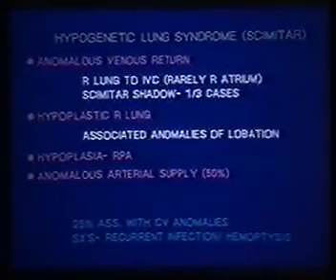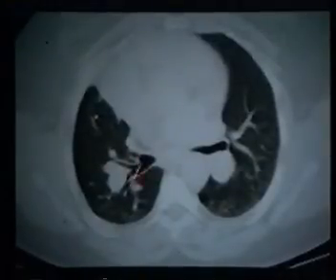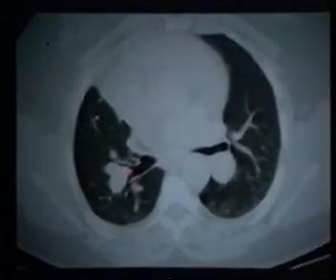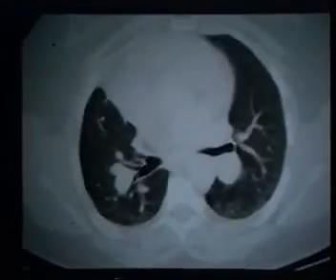Typically, these present without any kind of symptomatology. Now, we can make the diagnosis, I think, easily enough on a plain film. What we see on CT are anomalies of lobation. This represents really a left upper lobe bronchus on the right side. You can see there's hypoinflation of the lung and shift of the heart and mediastinum.